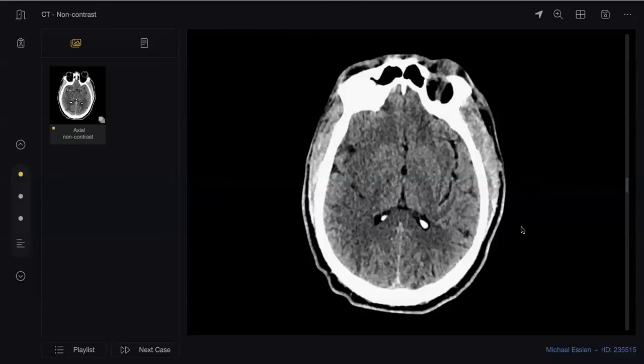So don't say MRI in the exam, say CT angio first. First you say stroke window, then you say CT angio if the patient is still on the table. If the patient is not on the table, you don't go for MRI directly in case of stroke; the patient goes to the stroke team.